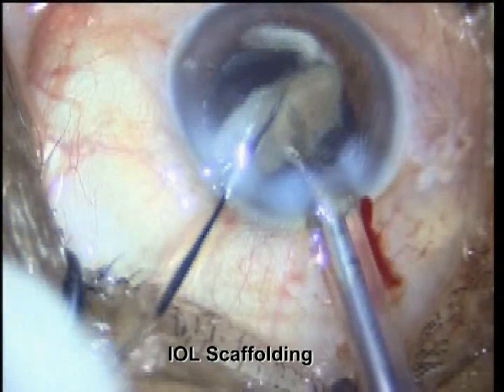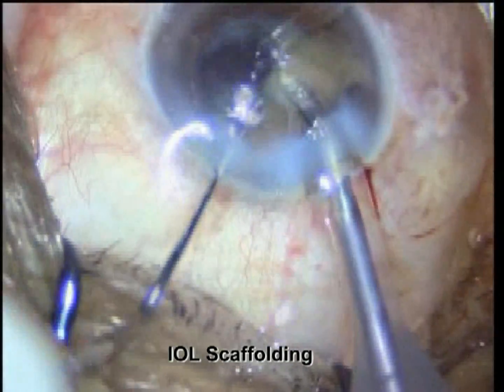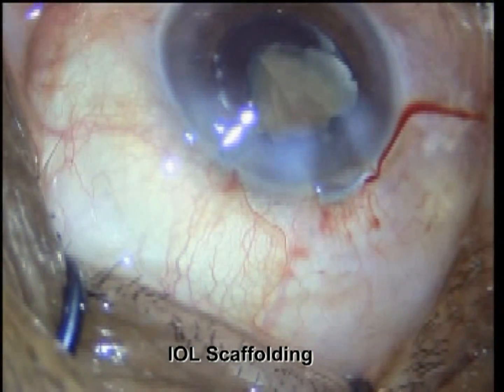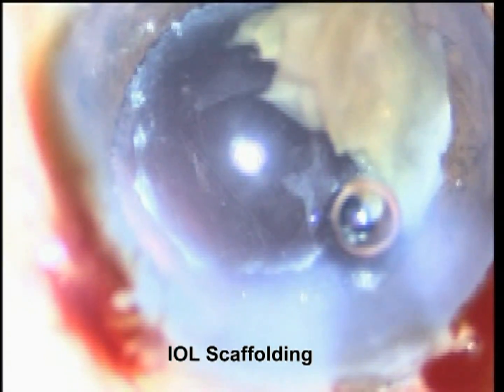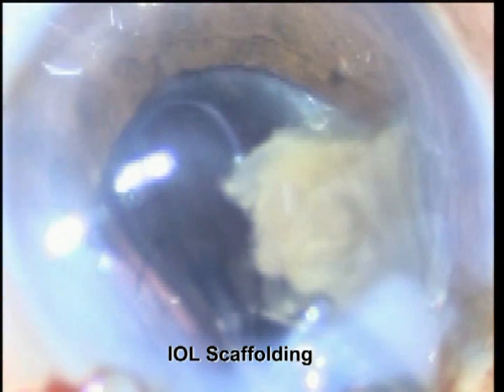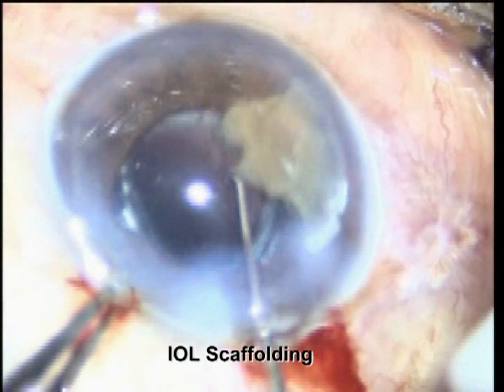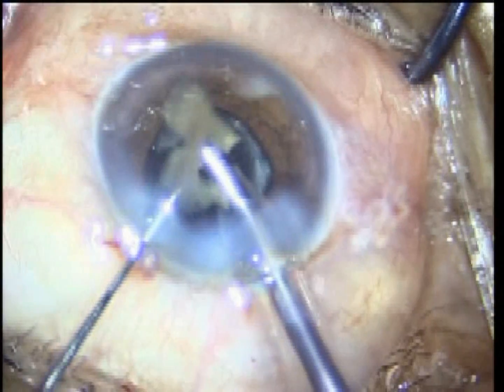Once, during nucleus management, a posterior capsule rent is present, one can go for IOL scaffolding. After recognizing the PCR during nucleus management with a nuclear piece still remaining, push high-viscosity viscoelastic substance. Here we can see the posterior capsule rent and the nucleus piece still present. A three-piece intraocular lens is implanted in the sulcus, which acts as a scaffold, and the remaining nuclear piece can then be very well emulsified.